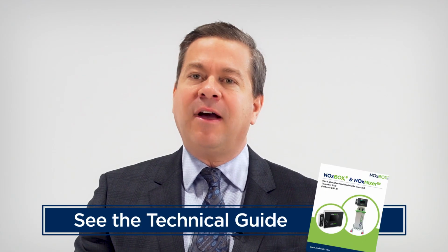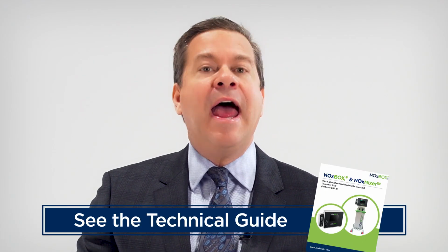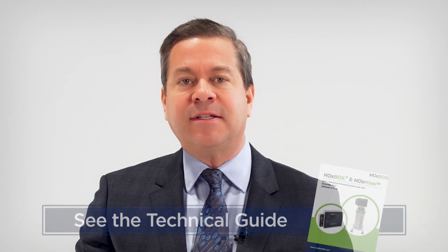That concludes our video training for the NOxBOXi delivery system. Please refer to the technical guide for more detailed information on how to safely set up and use the device. NOxVent, nitric oxide gas for inhalation, and the NOxBOXi system should only be used by hospitals that have received adequate training in the use of the drug and device and according to a physician's prescription.